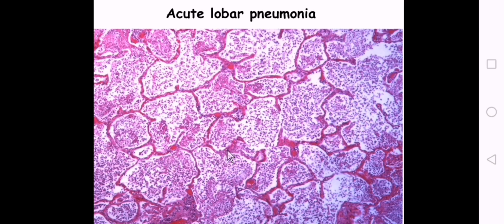وإذا تلاحظون هاي thin walled congested blood vessels scattered بالalveolar wall. فإذا هنا شنو changes اللي راح تشوفوها؟ يعني thickening of the alveolar wall نتيجة الإديمة والinflammatory cells infiltration with the presence of congested blood vessels. Plus the lumen is filled with inflammatory exudate.